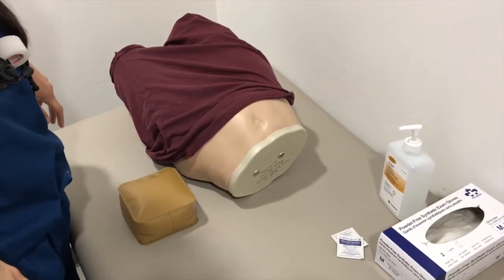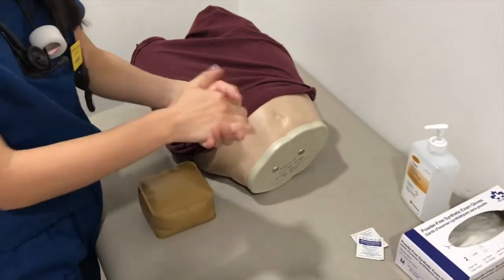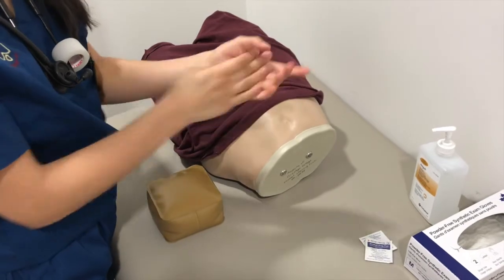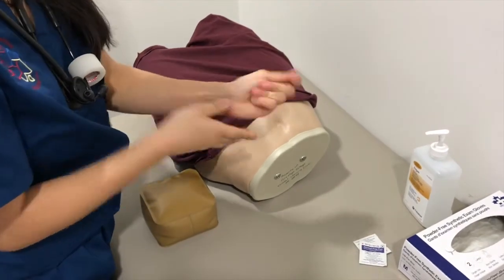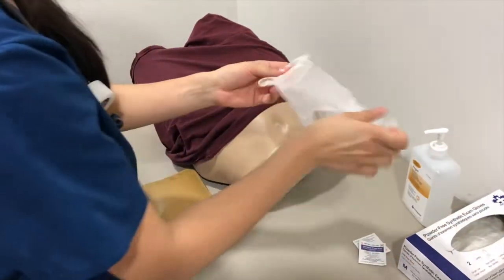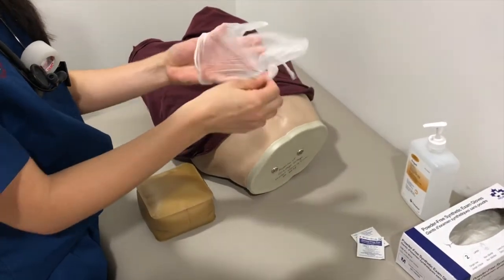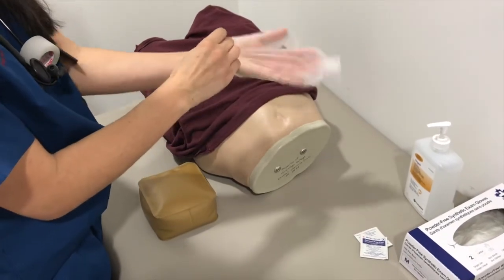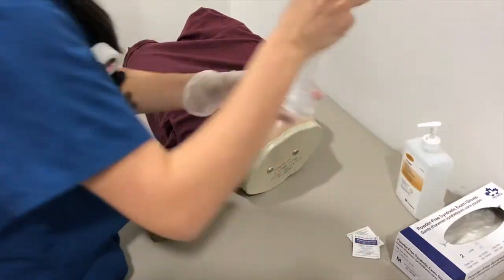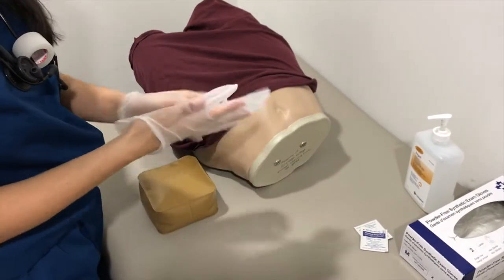So before coming into the room with your patient, it's always important to do hand hygiene. I am going to just do it right here just for your purpose of knowing that I did do it and I'm not lying to you. And also ensuring that you have proper gloves on. So in this case, I'm going to be putting these ones on right here. It's important to make sure that you have all your supplies close to you before giving any medications, just to reduce any risk of error or anything else like that.